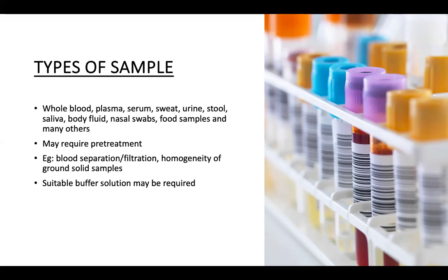You need to think about whether you need pre-treatment before you can put the sample on the sample pad, or whether you need some filtration system to be employed together with the lateral flow, and a suitable buffer solution as well, according to the pH that suits the analysis.